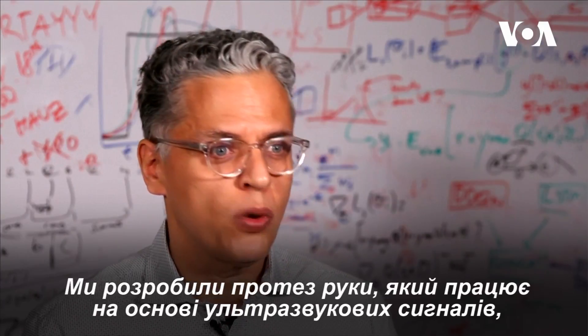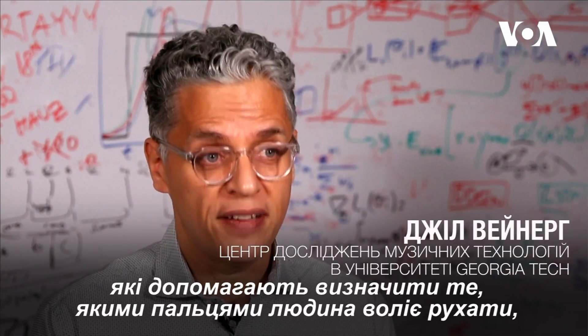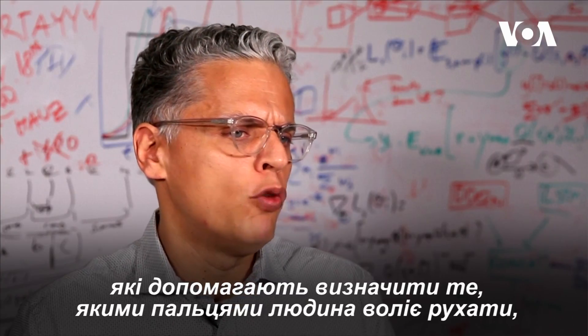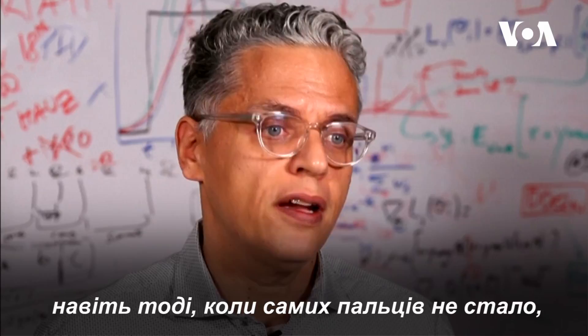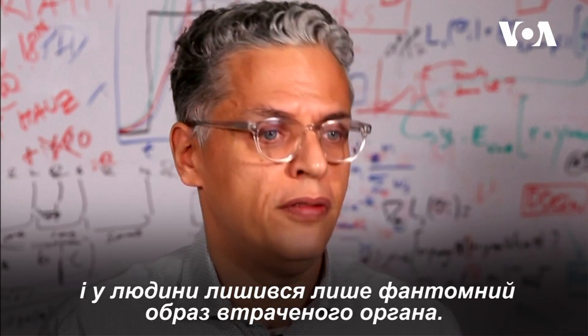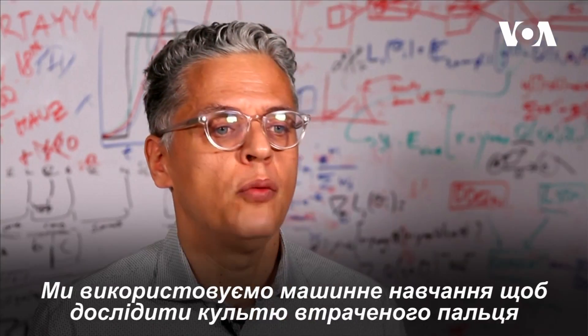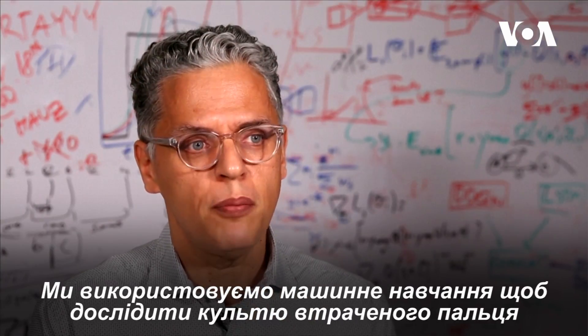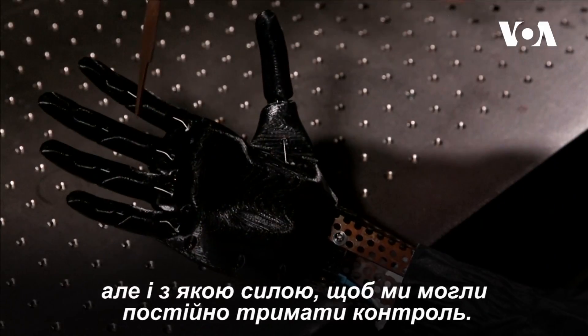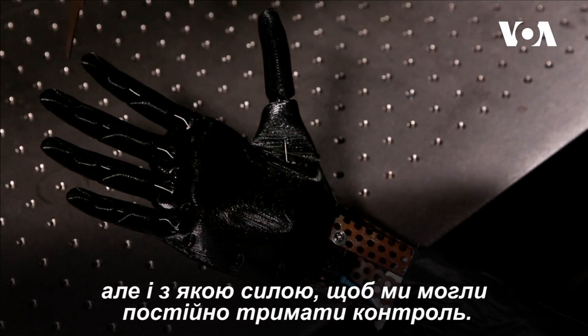We developed a prosthetic arm that works based on ultrasound signals that can detect intentions of amputees for moving their fingers. So we can detect what fingers they want to move even if they don't have the finger — it's just the phantom limb that they are operating. And we're using machine learning over the signal to see exactly not only what finger is being pressed, but how much it's being pressed, so we can do continuous control.